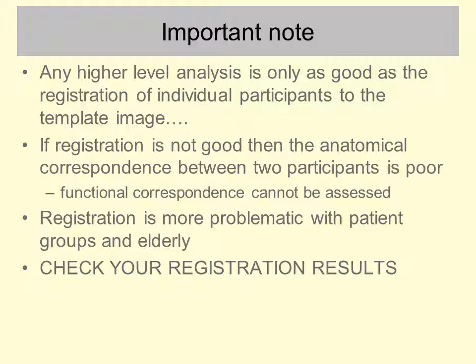Make sure if you're in that situation where you're batch processing data that you at least look at the registration results of the individuals, and also I would say look at their motion plots as well to see which ones may have moved excessively. That's the end of the lecture.